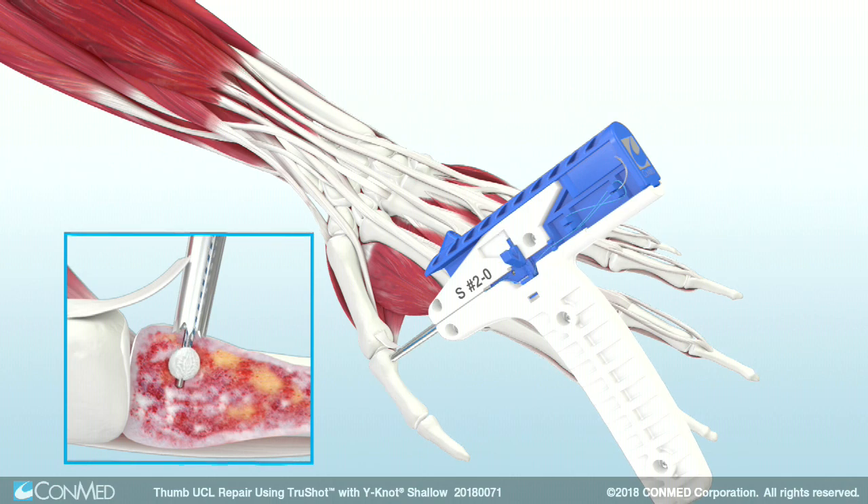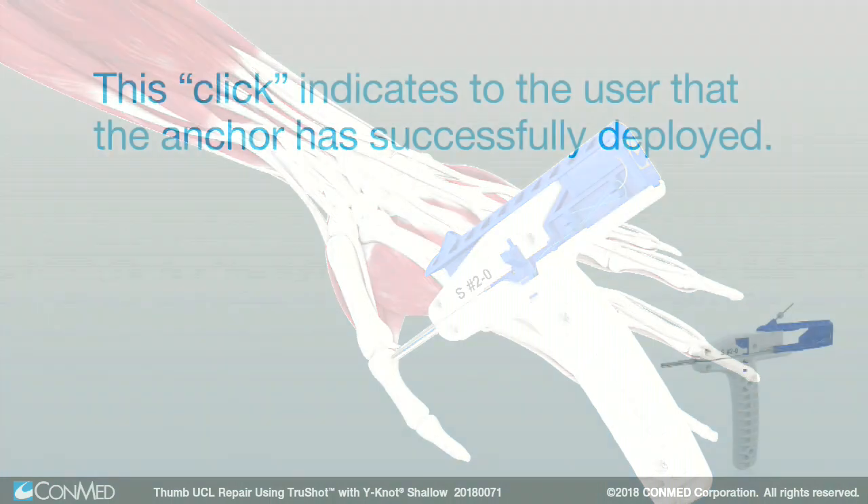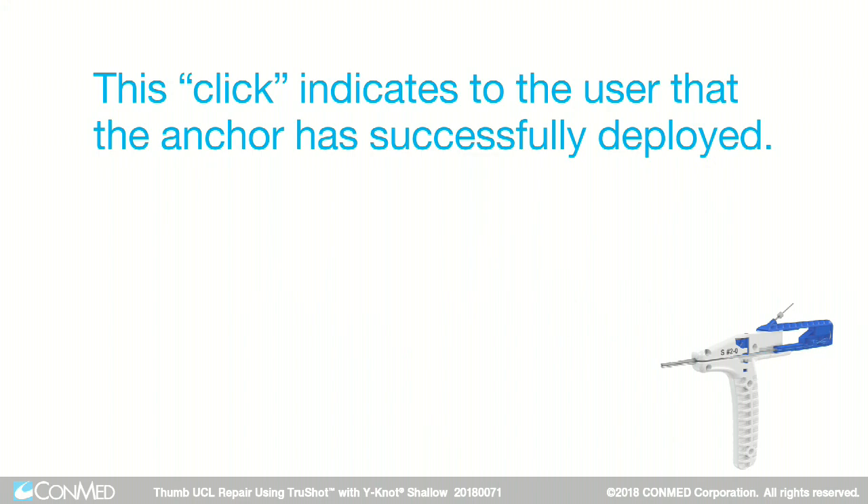Use your finger to apply pressure downward until an audible click is heard. This click indicates to the user that the anchor has successfully deployed.